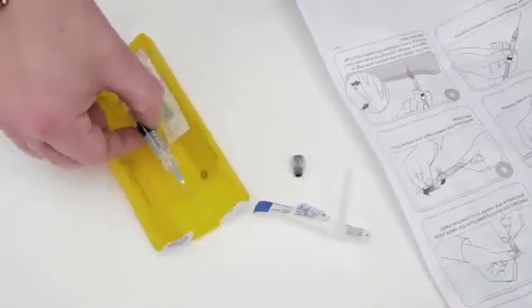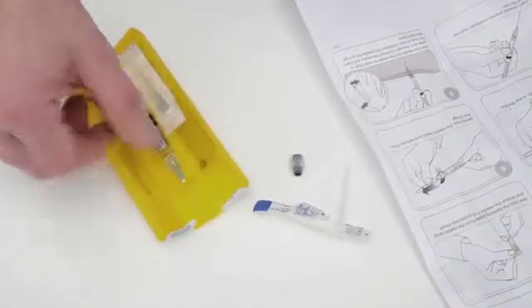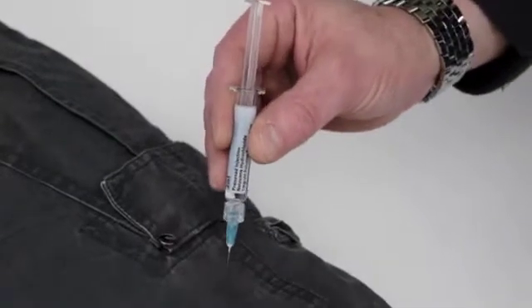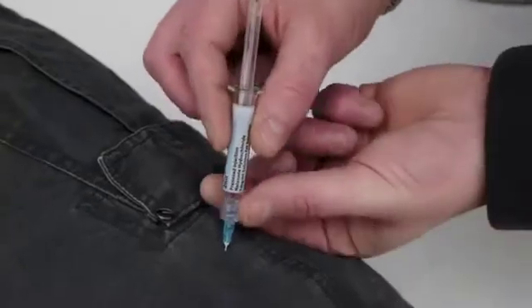Withdraw the needle and put the syringe with the needle still attached back into the cradle of the Pronoxad injection case. If you need to give another dose, insert the syringe again near or around the same site, and inject to the next black line.